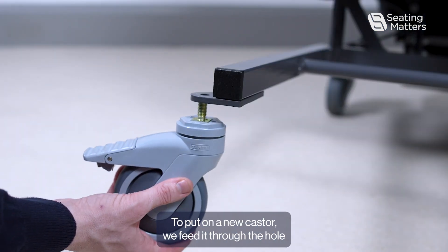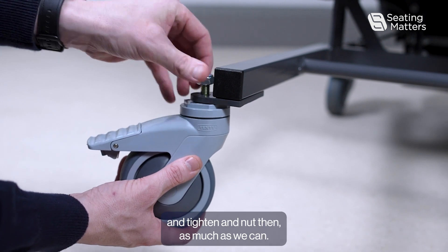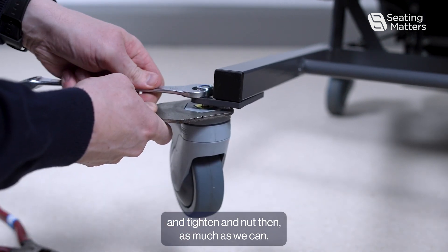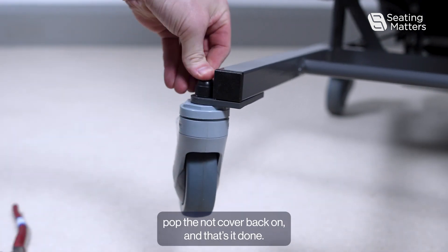To put on a new caster, we feed it through the hole and tighten the nut down as much as we can. Once we have that fully tight, pop the nut cover back on and that's it done.